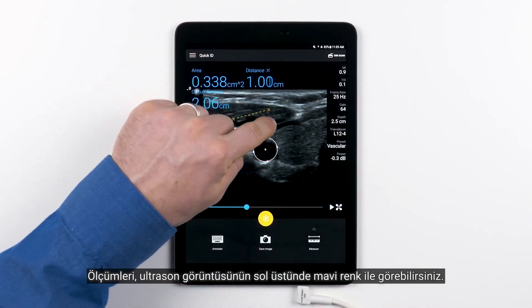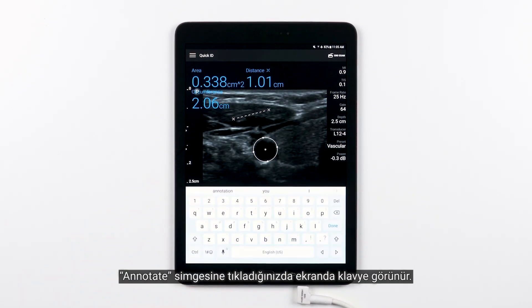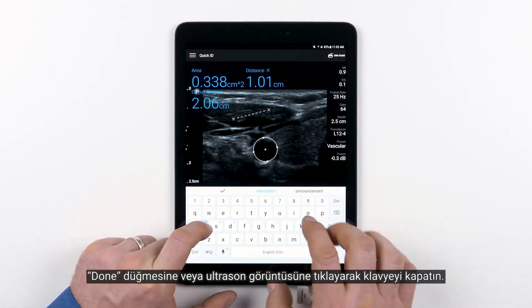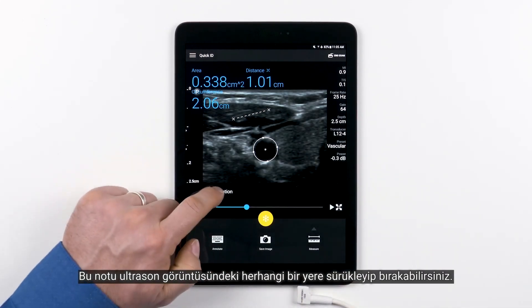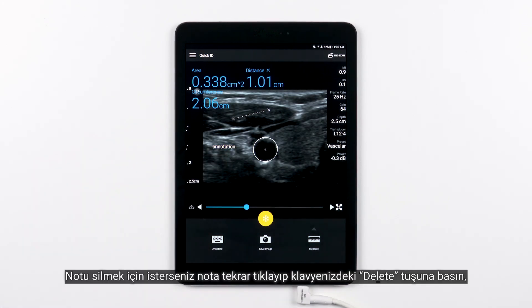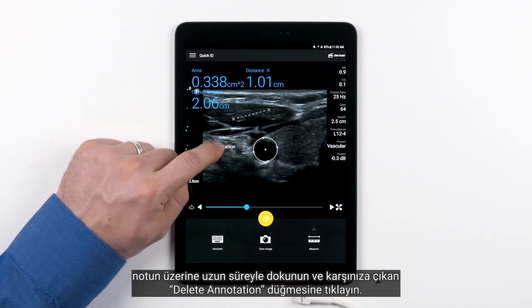You'll see the measurements indicated in blue in the top left of the ultrasound image. You can also annotate a frozen image. When you touch the icon for annotate, the keyboard comes up. Type your annotation, then tap Done or tap off of the keyboard onto the ultrasound image. Drag and drop that annotation anywhere you like on the ultrasound image. To delete the annotation, you can either tap on it again and hit the Delete key on your keyboard, or you can long press on the annotation and hit Delete annotation.